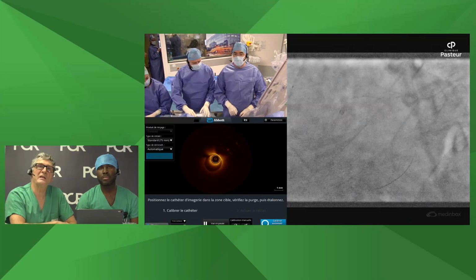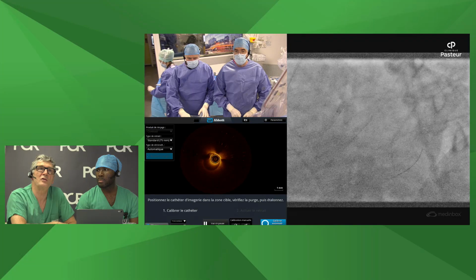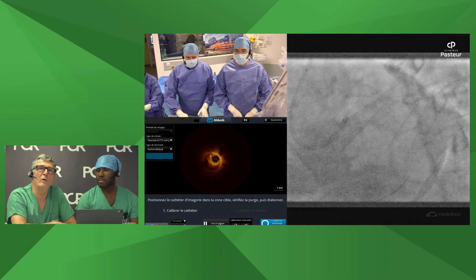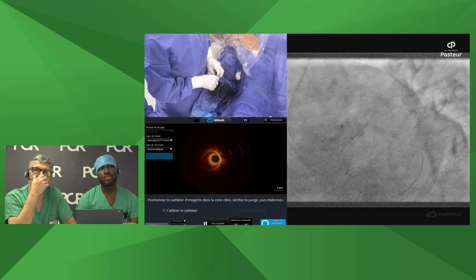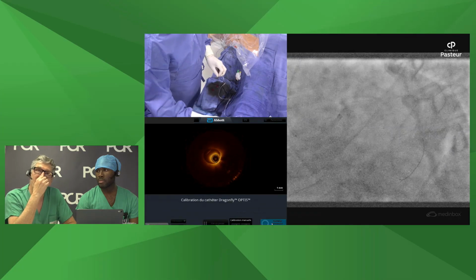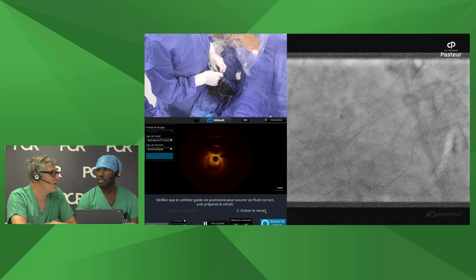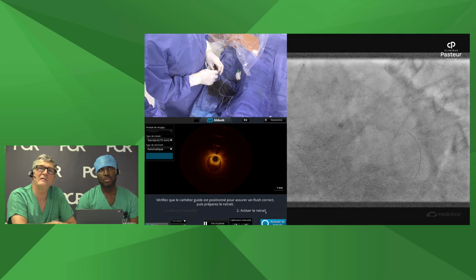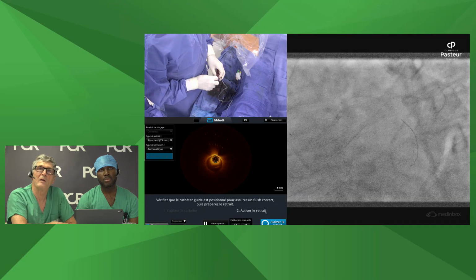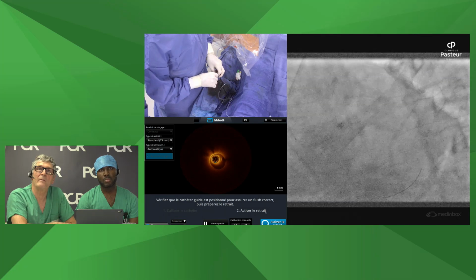What is important for the left main is the amount of contrast that you are injecting in order to have a perfect view. In my lab, we are following the recommendation of Pascal Motreff, who said that we should use the size of the left main plus 1 cc, so it should be 6 cc per second, with an automatic control.